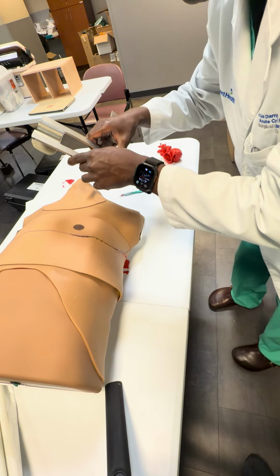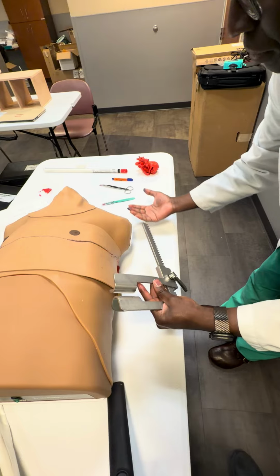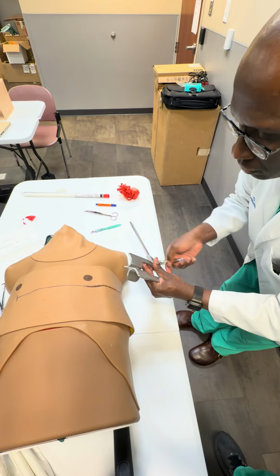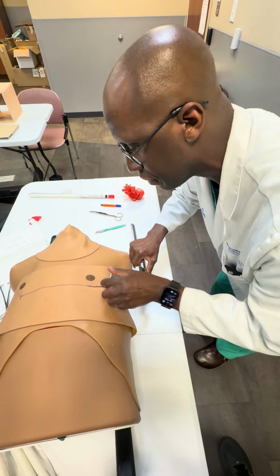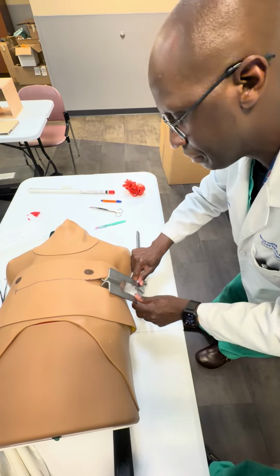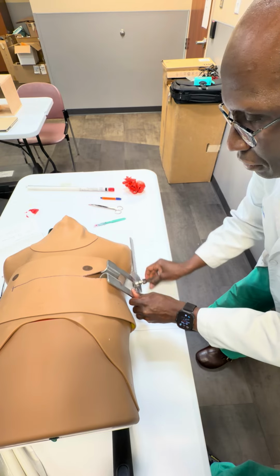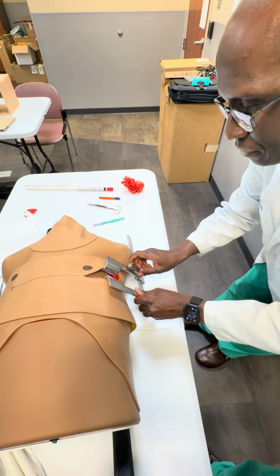I'm going to put my Finochietto retractor, and again, you want to make sure this is lined up with the pole extending toward the head. Ideally this is already set up before you even started this. I'm going to put my rib spreader in, and I'm going to be very generous with how I spread, okay?